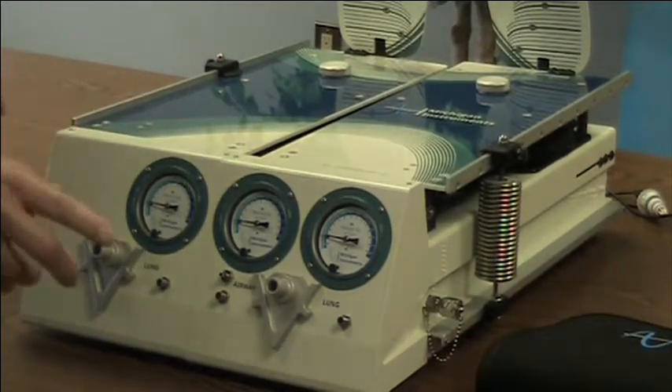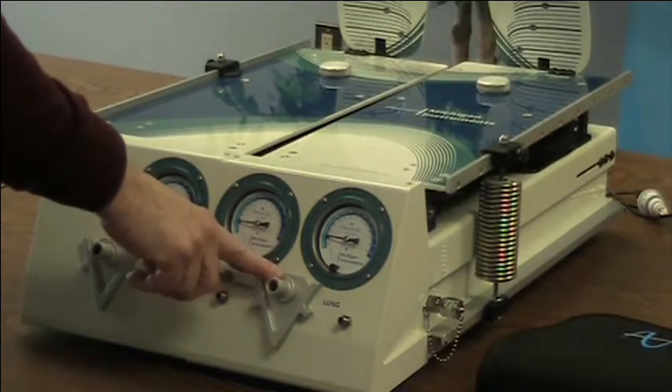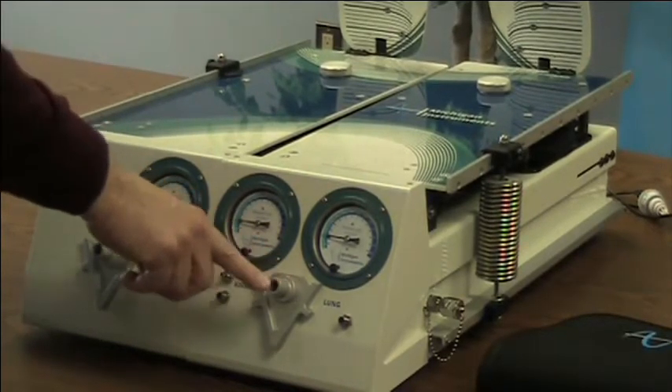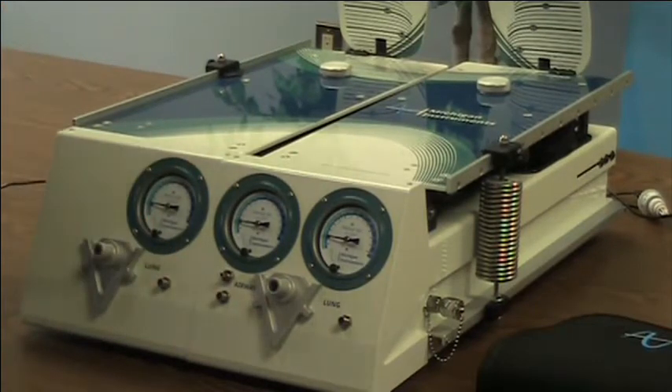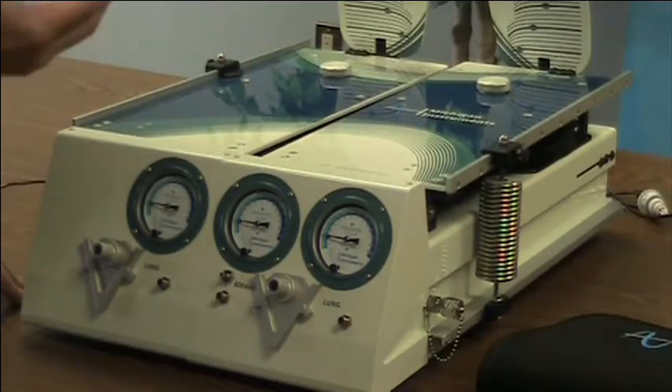The other thing we simulate is airway resistance, and we do that by assembling an airway outside the lung that incorporates one of the many airway resistors we provide in our kit.